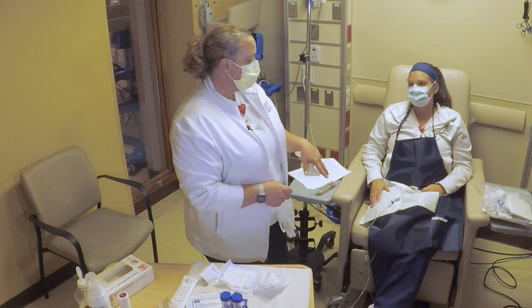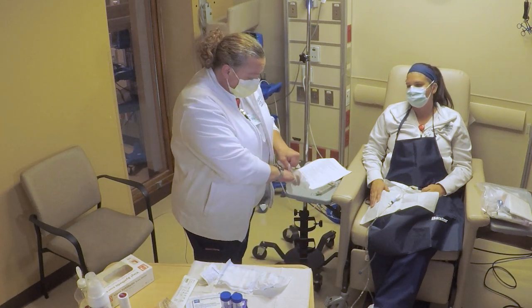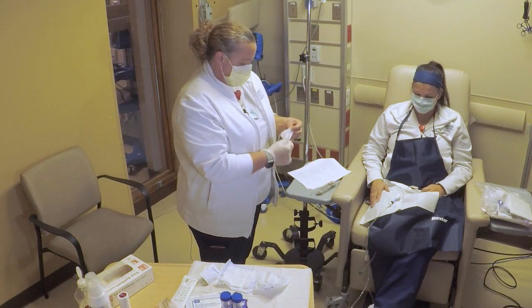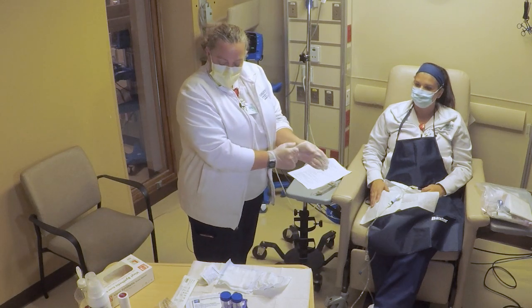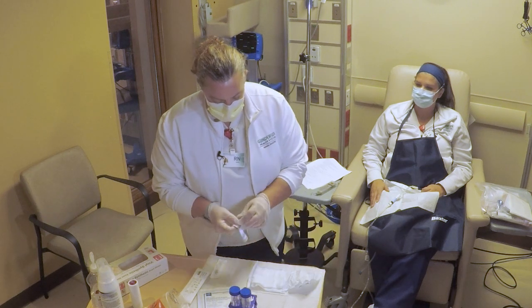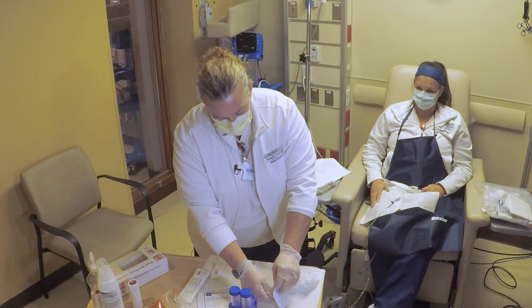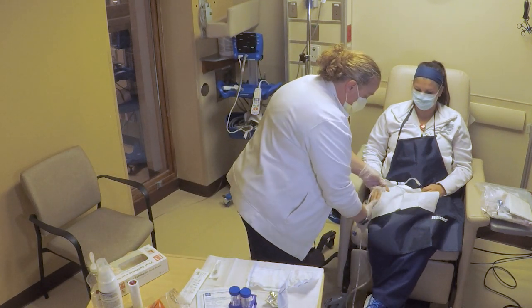So after your patient has everything drained out, what we're going to do is disconnect this bag from the transfer set. You'll have your gauze and your mini cap. Close your transfer set.